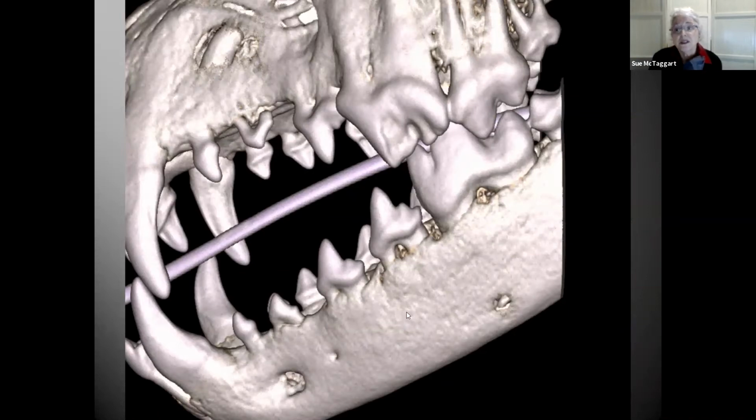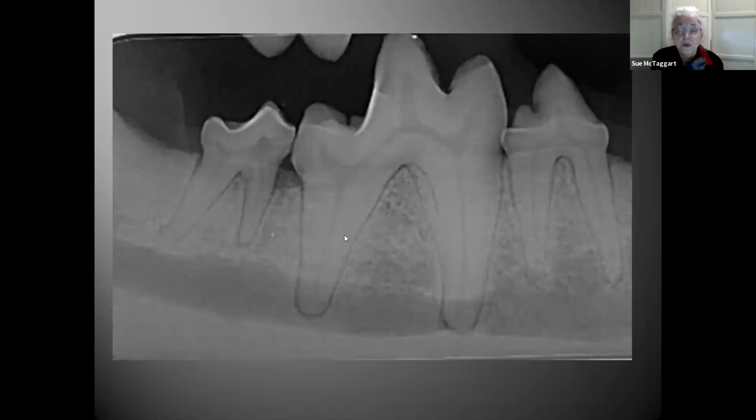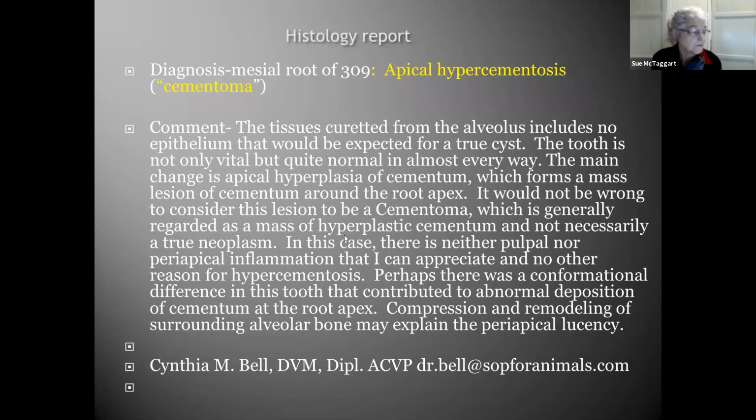I was blown away by the ability of the cone beam to show a lesion in the mandible that 2D radiographs didn't show. And up until now, I was under the impression that imaging of the maxilla was better with the cone beam, but that 2D was just fine for the mandible. Can you see it here? So the lesion and its relationship to the mandibular canal can also easily be seen on this axial cone beam view. There's the canal, and there's the lesion. It was not bilateral. Contralateral tooth 409 appears to be normal. So tooth 309 was extracted and the root was sent to Cindy Bell for analysis, as I suspected a periapical cyst, and she's doing a study of that specific pathology. And I got a nice report from her, that you can get.